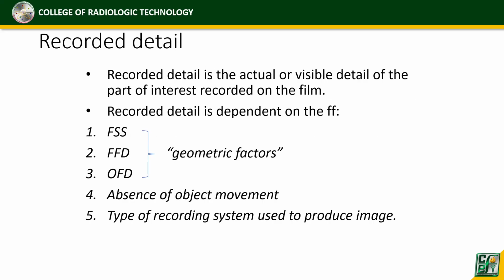So recorded detail naman is the actual or visible detail of the part of interest recorded on the film. Recorded detail is dependent on the following factors. Of course, the geometric factors, we have the FSS, FFD, and OFD. Okay, ano ibig sabihin ng FSS?